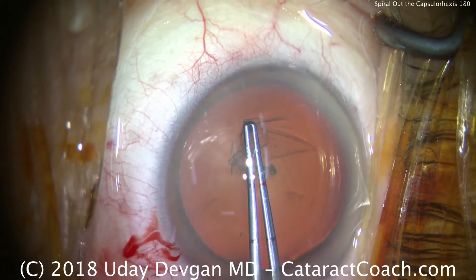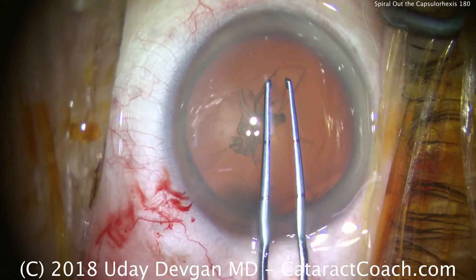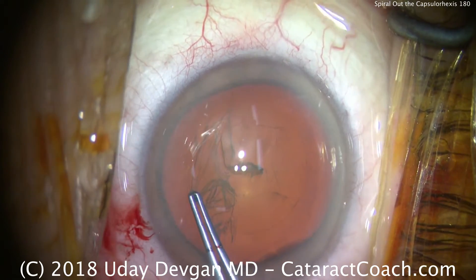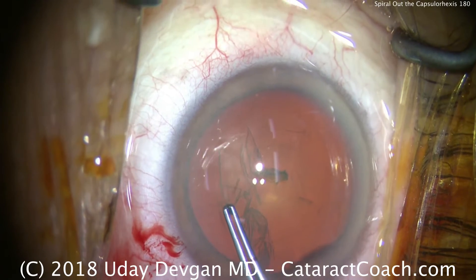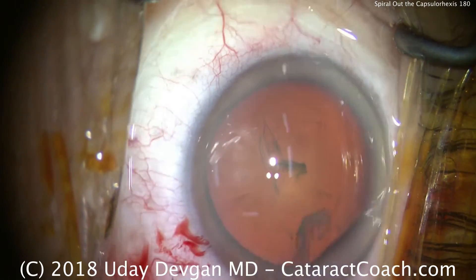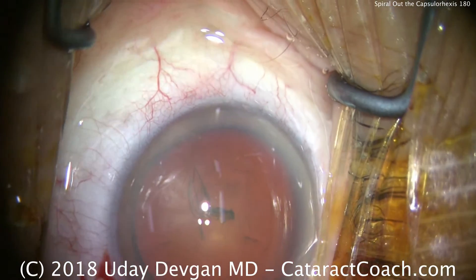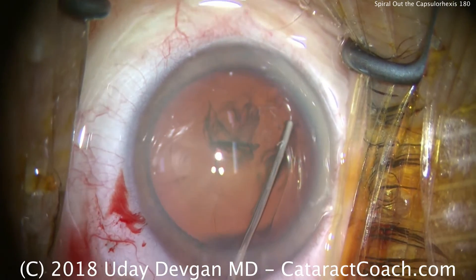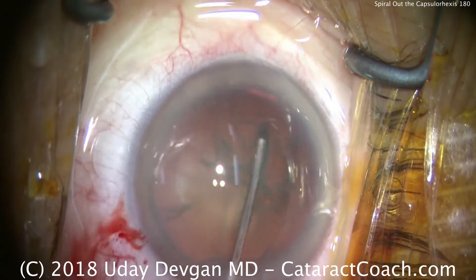Take our time, nice and slow. No rush at all. We're keeping that exact same size. But now when we come back to the beginning, we're going to have to go past the 360 mark and continue till we have the entire rexis that size. That spiraling out technique allows us to really dial in the exact size we want. It's easier to do it that way than to just try to start off with exactly a 5mm rexis.